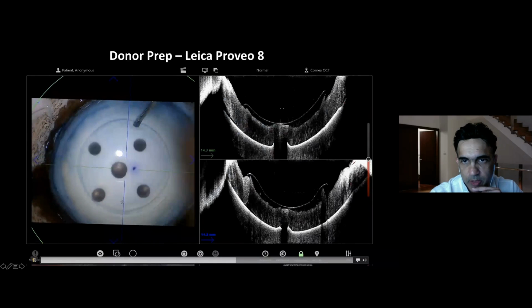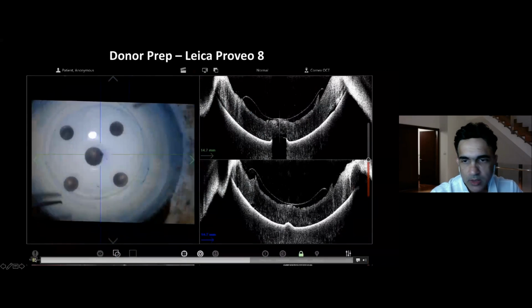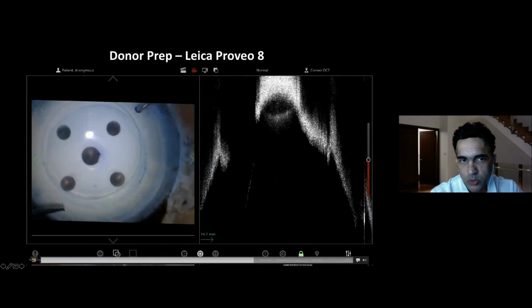Okay, so I'm just going around and lifting it up. And I typically go around all the way. And you can see quite clearly how much fluid there is, again, on the tissue itself. So a little bit of fluid, not too much fluid, but there's enough there that I know the graft won't go into a scroll itself.